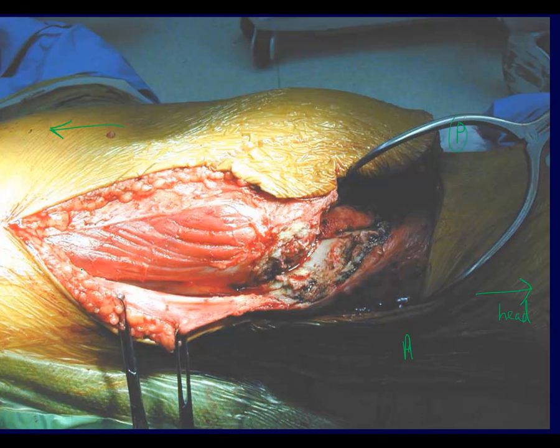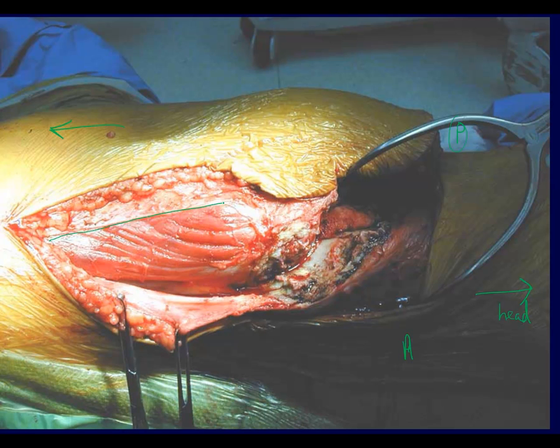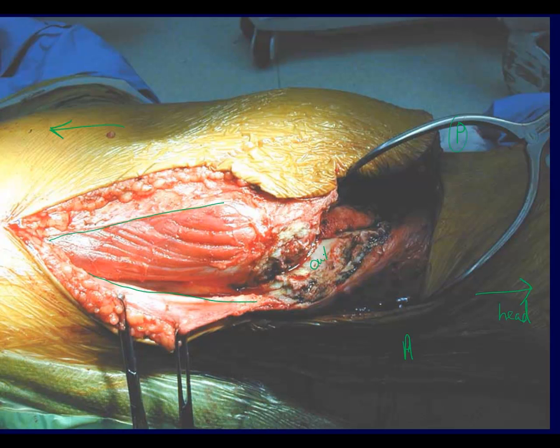Here you can see the inverted J incision. The tensor fasciae latae muscle has been elevated and the fascia has been incised. Here's the outer table, and we're now starting to make our way down towards the greater sciatic notch.